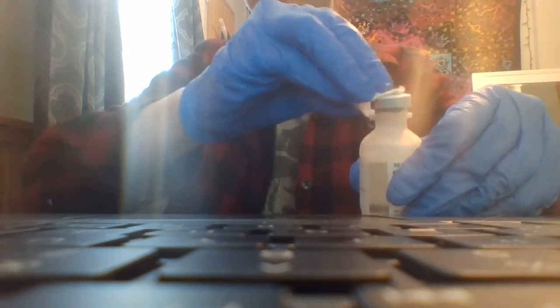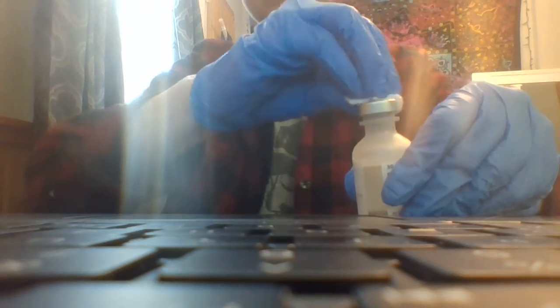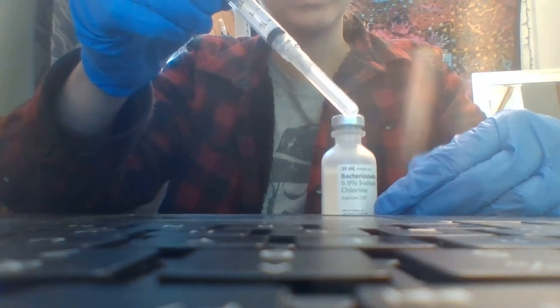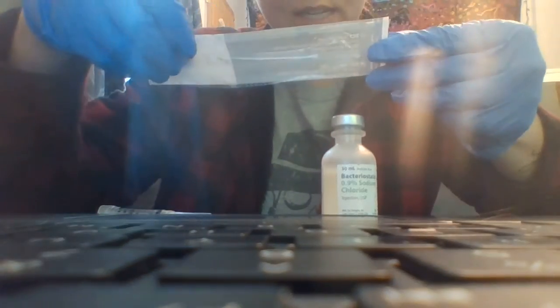I'm going to clean the vial for 15 seconds. And I have my needle. For an IM injection, it's necessary to use a 1-inch needle, 22 to 25 gauge. So I am using this, which you probably can't see. It's a 22 gauge 1-inch needle.